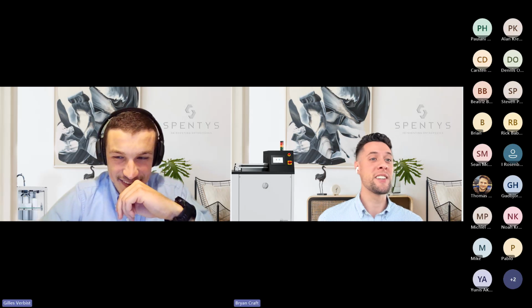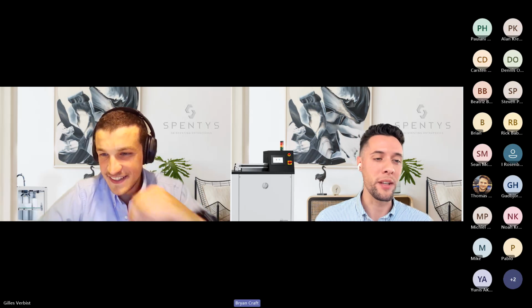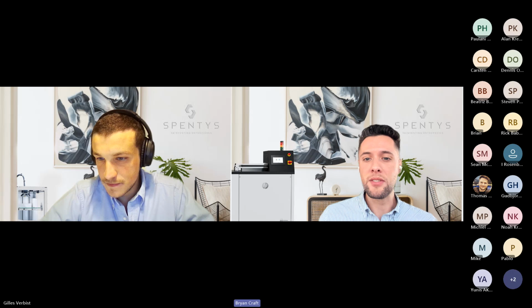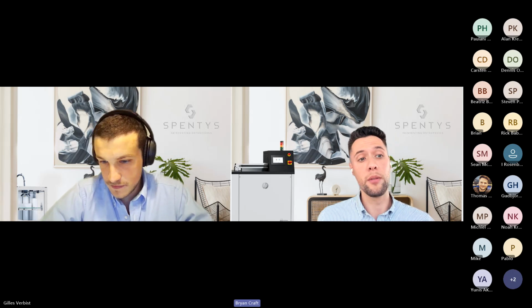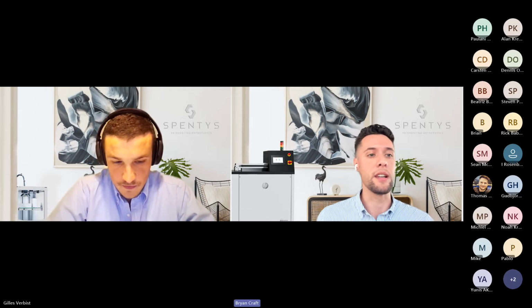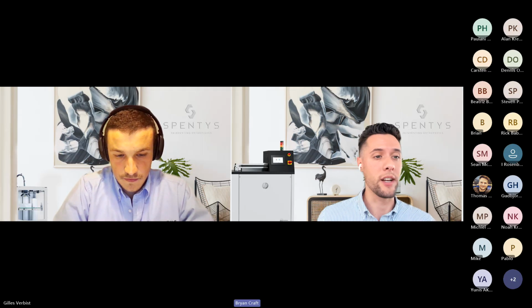Okay. Yes. So the line of Spenty's 3D printed devices are really for kiddos. And there's really not a length limit. It's more of a weight limit. And we figured out those limits through our R&D process. So testing, cyclical testing, lots of testing.